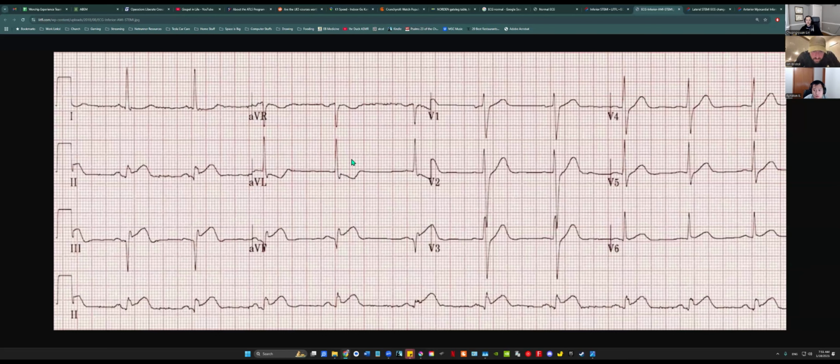Good. Now, in terms of the left laterals, do you see any other changes? In lead 1, it's slightly depressed, and that's why I didn't say anything about that. When it's less than half a millimeter, it doesn't really count. There's a slight curve down too. I wonder if there are respiratory artifacts. In V5 and V6, if someone's breathing heavily, you can see the baseline end up like a sine wave. So this one is essentially normal.